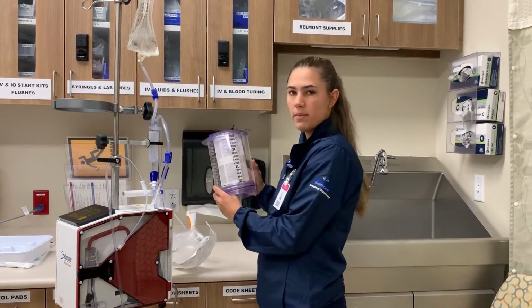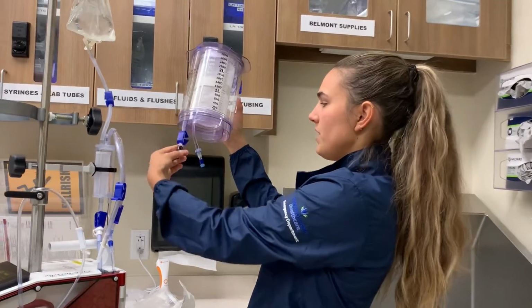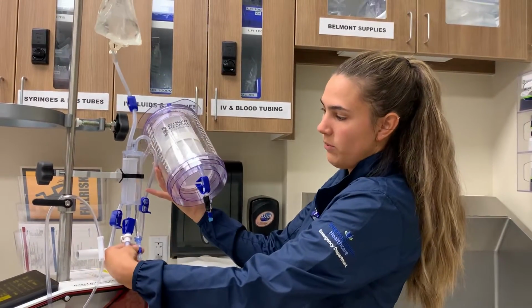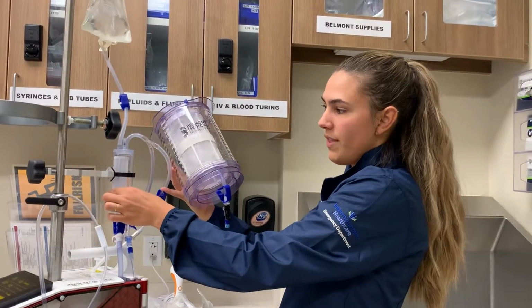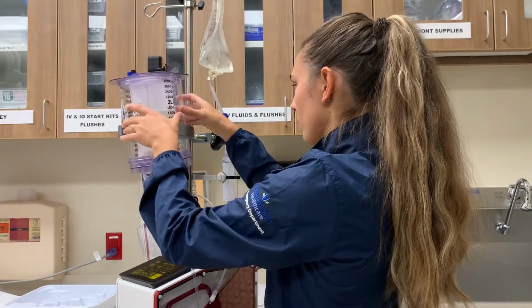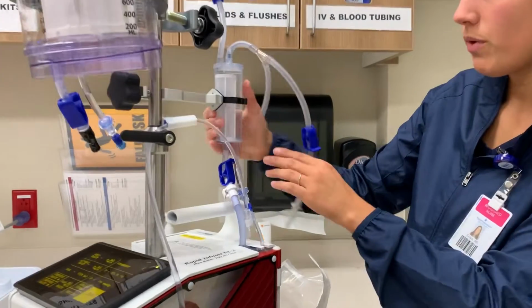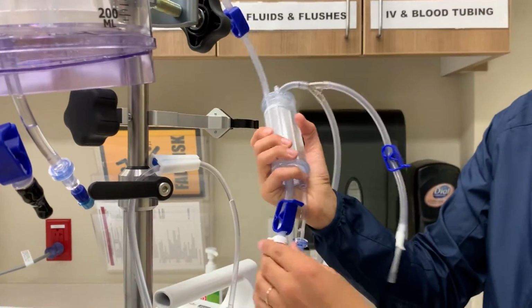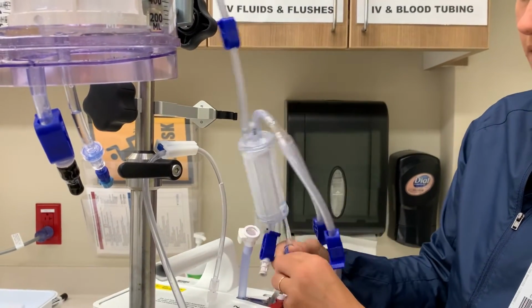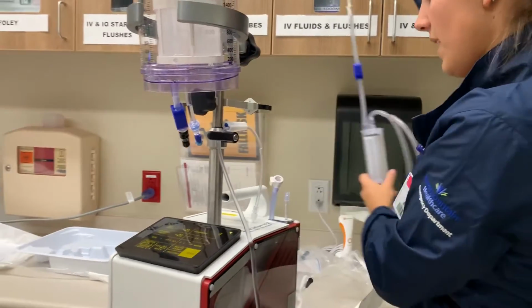So you'll remove it from the packaging and you'll see it has these two parts of tubing down here. And these are going to connect to the tubing right here. So I'm going to remove the chamber and I'm going to connect this canister instead. And then you can remove the chamber by popping this off like that and then untwisting. So we can get that out of here for now.